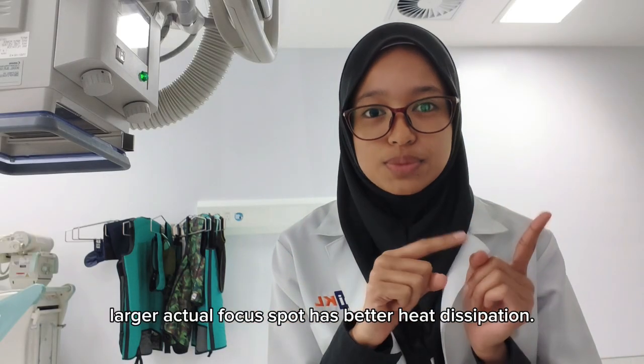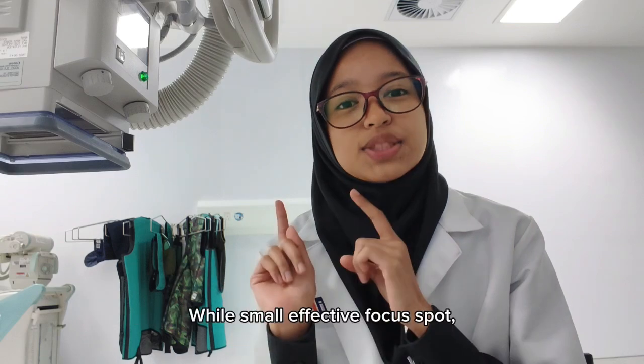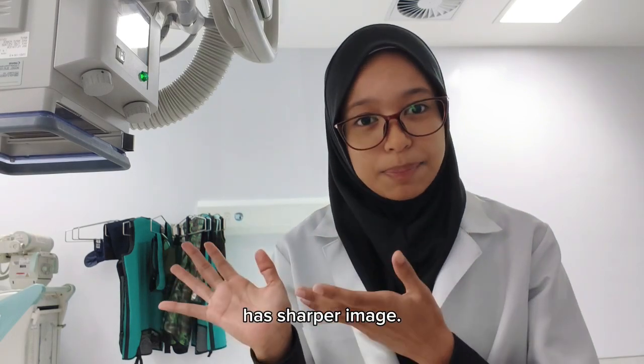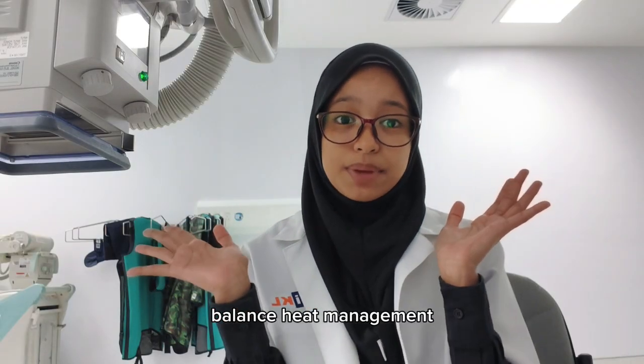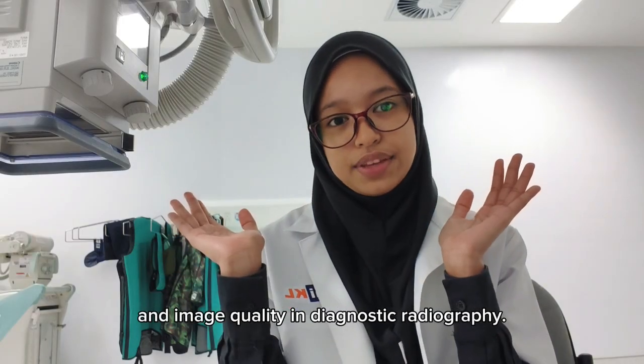In short, a larger actual focus spot has better heat dissipation, while a small effective focus spot gives a sharper image. This principle balances heat management and image quality in diagnostic radiography.